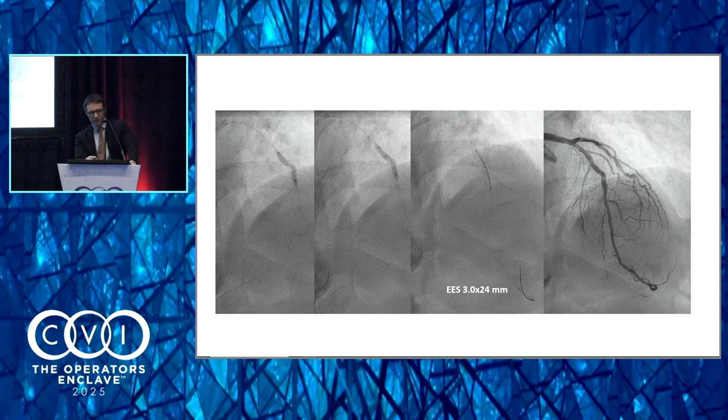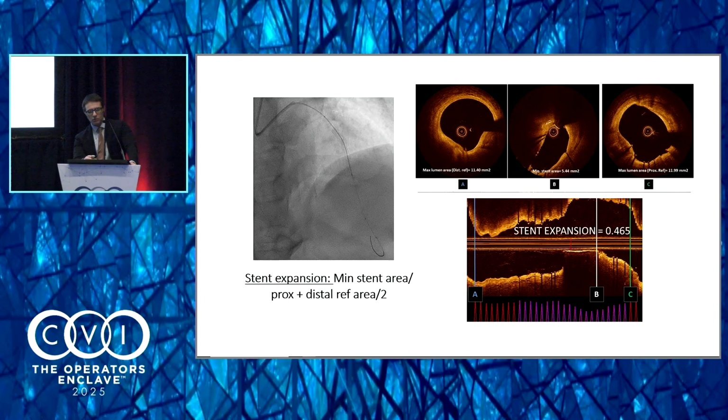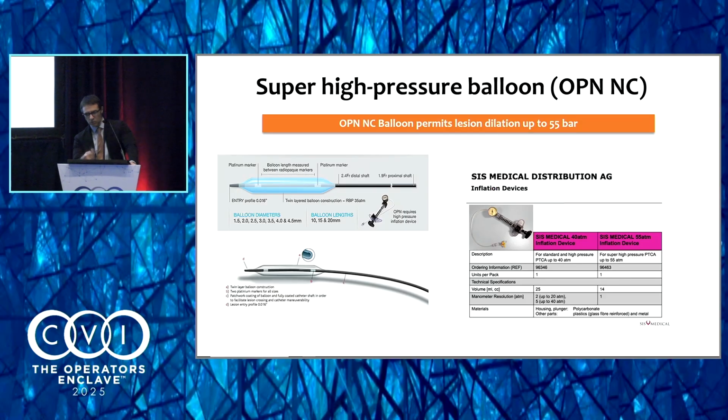And the high pressure balloon dilated the artery, and we were able to put a stent. This is the final angiographic result. Per protocol, we had the possibility to perform the OCT, and this is the problem, what you see on the OCT. It looks good angiographically, you perform cutting balloon, you perform rotablator, you think I'm okay, you are not. Not at all.